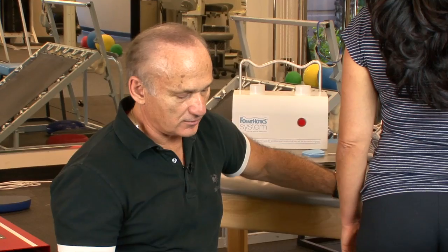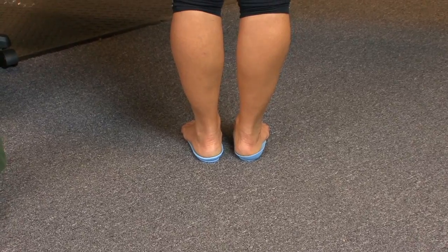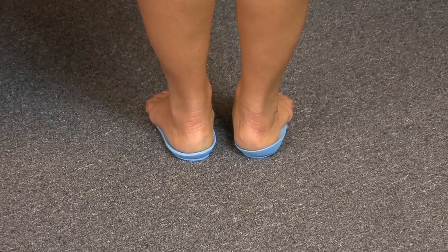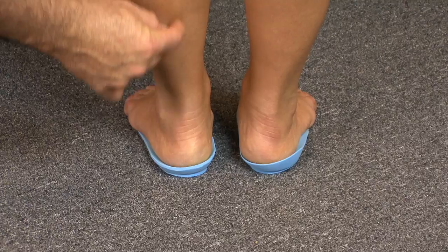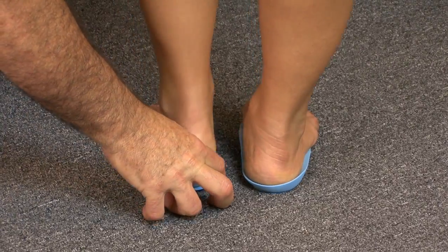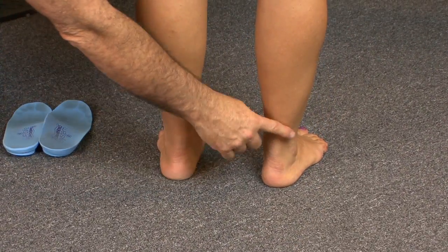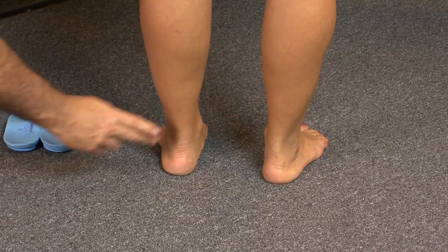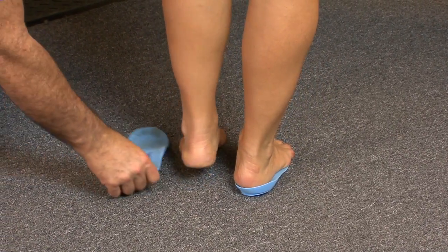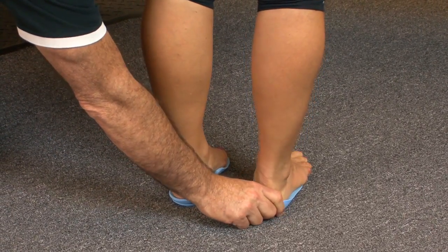My patient Georgiana is back, standing in the orthotics with the rear foot varus wedge — not valgus in this case, because we're controlling over-pronation. You can see much better alignment with the calcaneus lined up to the lower limb. Now step out of them and stand without — you can see how the calcaneus returns to that everted, valgus position. And stepping back on them, the alignment improves again.